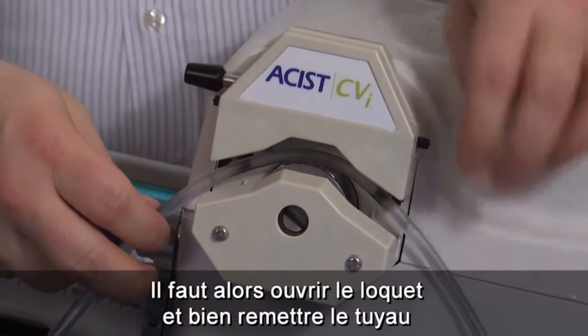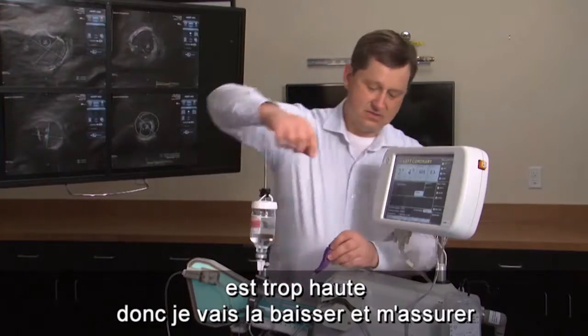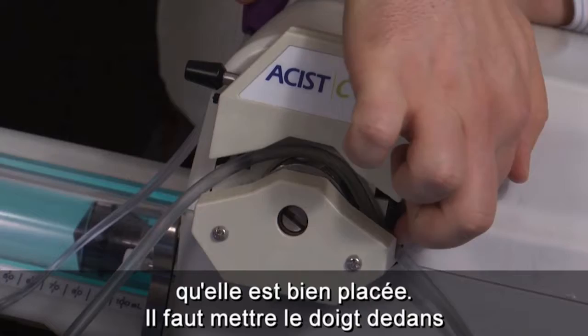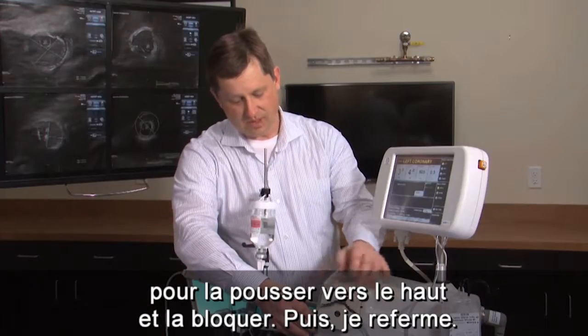You want to open the latch, straighten the tubing in case there are any kinks in it. This tubing guide is too far up, so I'm going to put it down and make sure it's where it needs to be. Then I put my finger in to pull it up to lock it, and close the latch.